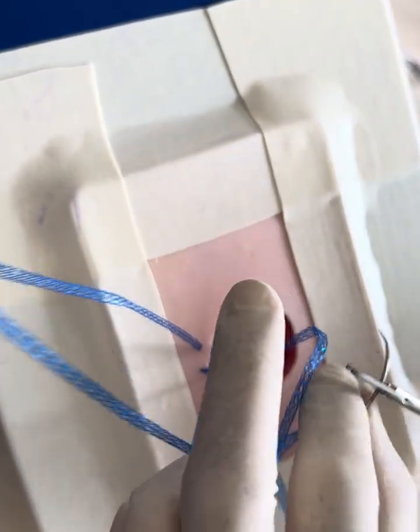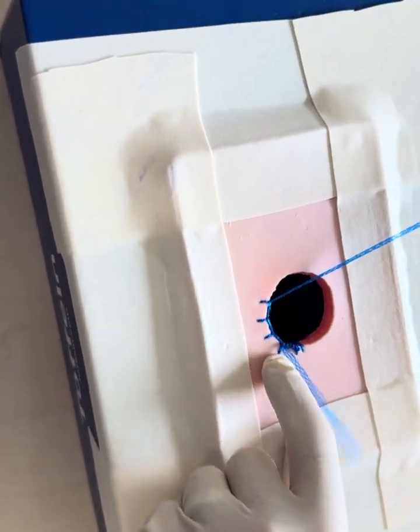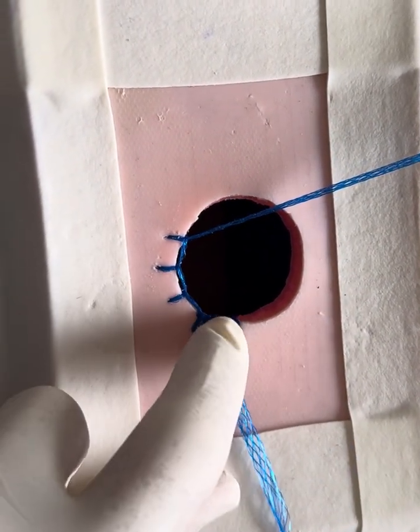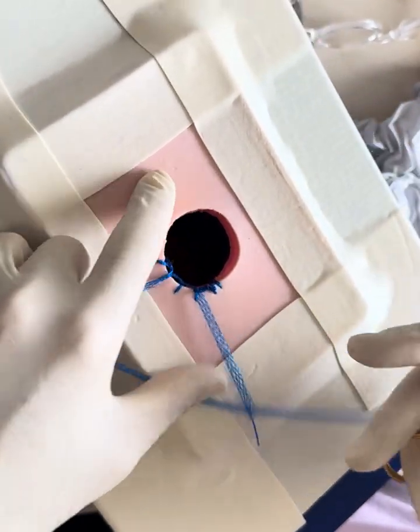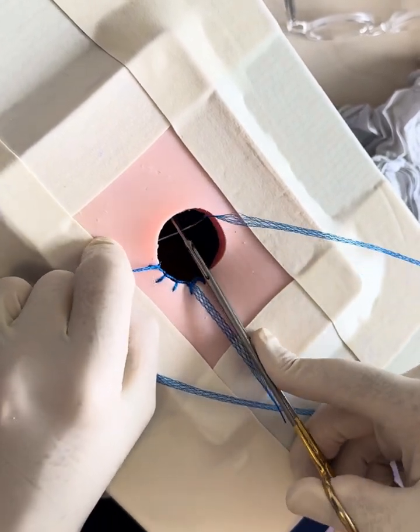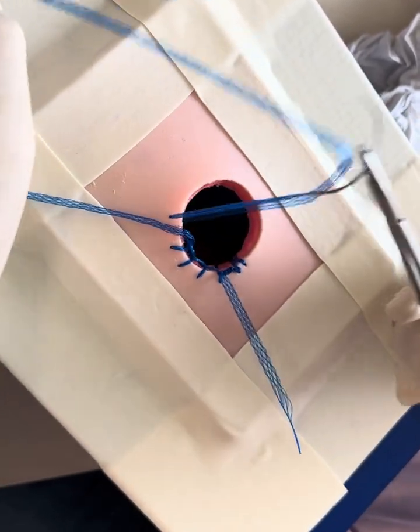And through our loop, so we continue our mattress. And as we can see, we get the reinforcement around, and we get the suture lying along the edge of what would be the muscle layer. And therefore we're getting the benefit of mesh reinforcement on the edge of the stomal opening.